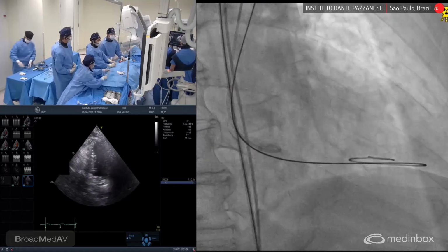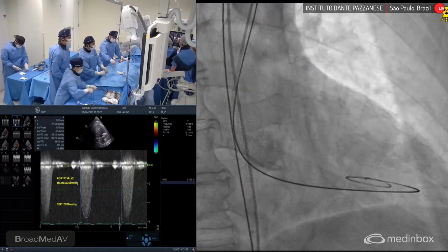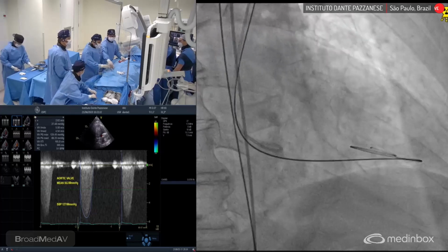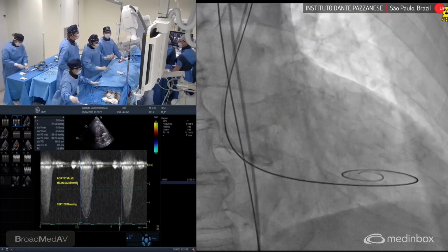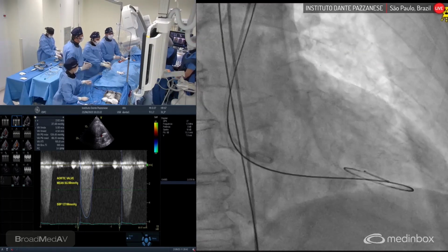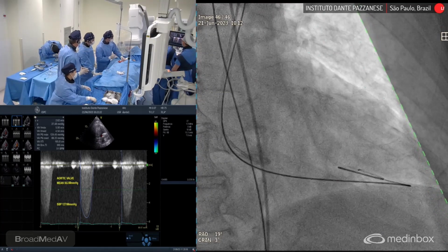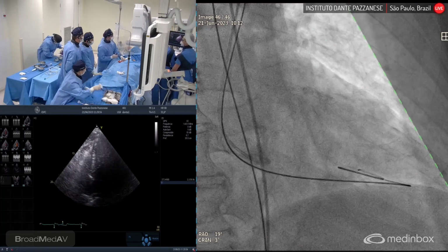Great, thank you. Because this patient has a small ventricle, a very, very small hypertrophic ventricle. And as you could see in the EKG, I used to make a joke here about the EKG. I can see the echo images by the EKG. I make a joke with the echo guys here because the EKG is very important, because I'm old fashioned. I really didn't have echo to see everything at that time.